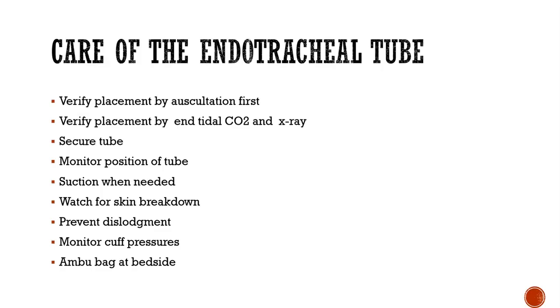And then we want to prevent dislodgement. Patients can self-extubate. They can be little Houdinis. I've had that happen a couple of times, when I've been in my other patient's room and somehow they get out of their restraints. Obviously your restraints should never be too tight, but they should be tight enough that your patient can't get out of them. One of mine was a patient who was detoxing off of drugs and just had superhuman strength. The other one, I'm really not sure what happened. She was really tiny, so I'm thinking she may have just finagled and slipped out of one, and she just pulled that thing right out.